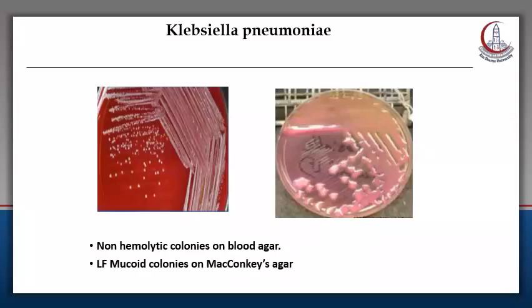In case of Klebsiella pneumoniae, if this patient is having typical pneumonia because of Klebsiella pneumoniae, the effect on the different plates will be as follows. The picture on the left side is for blood agar, and the effect of colonies on it is no hemolysis, or gamma hemolysis. As we lift the blood agar in the light, there will be no transparent zone around the colonies.